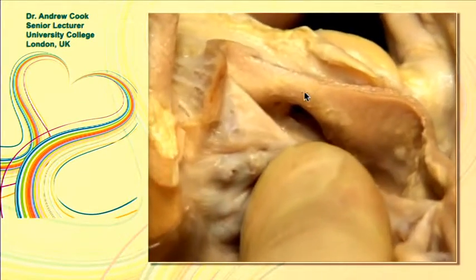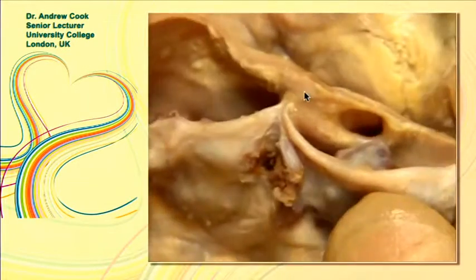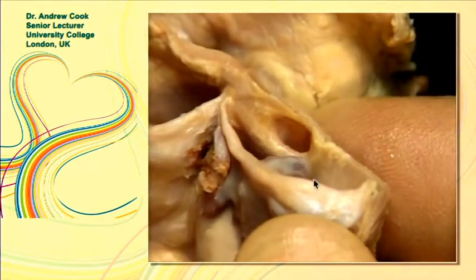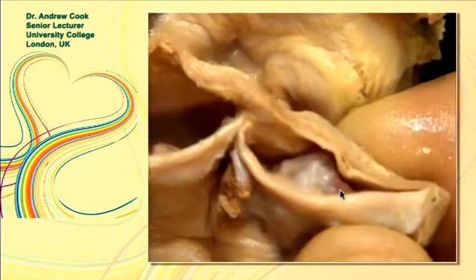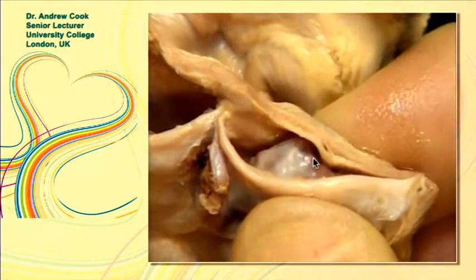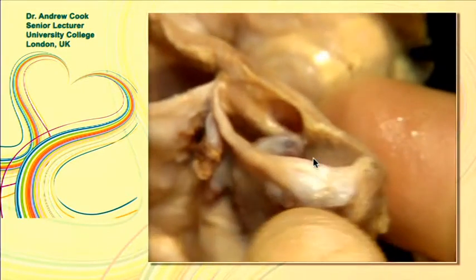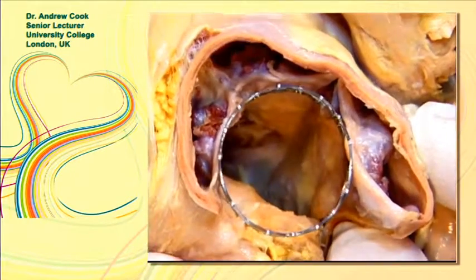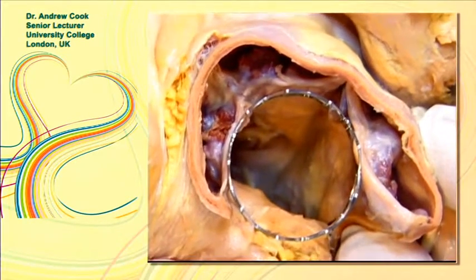But if we turn our attention to the left coronary artery, just here, you can see it's much closer to the valvular tissue, and in fact, there's a calcific nodule there that just wants to fall into the origin of the left coronary artery there. So knowing the coronary origins, I think, is crucial.